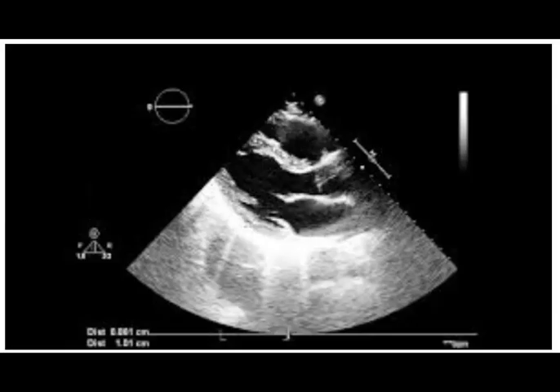And as far as that goes here, you're going to look on our screen and you're going to see up in the right hand corner on our machine, a grayscale map. Typically at the top of that map, on the Philips products, it'll say map 2, map 3, map 4, whichever map you're using. And it'll have a dark to light band on it, so that depicts that particular grayscale, map 1, 2, 3, 4, 5, whichever one you're using. When we turn our color on, it comes right up beside our grayscale right over here.